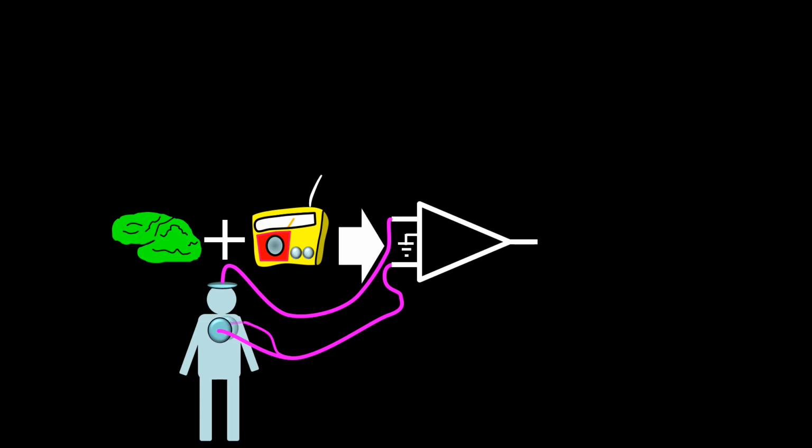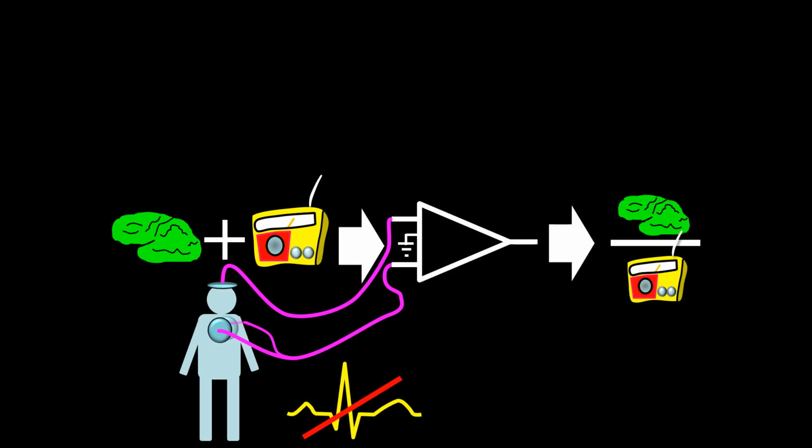Then they decided to improve on the use of an anterior chest wall electrode by using a second electrode in the posterior chest wall or posterior neck and connecting the anterior and the posterior electrodes together to input 2 of the differential amplifier. This way, EKG artifact was greatly diminished and the cerebral activity was better visualized.